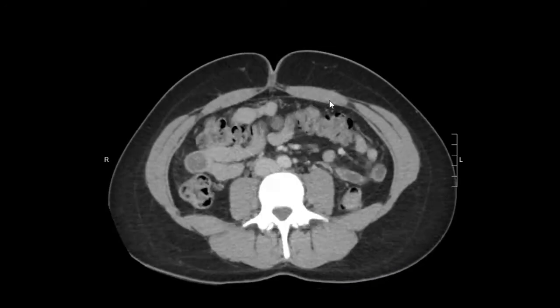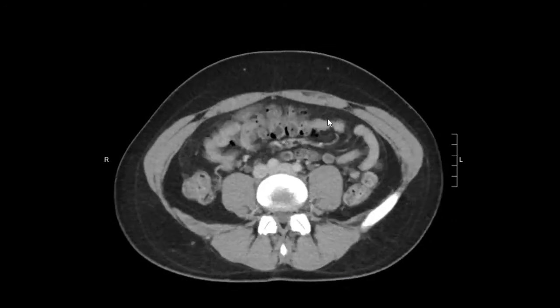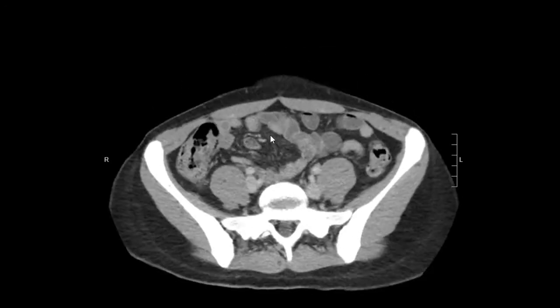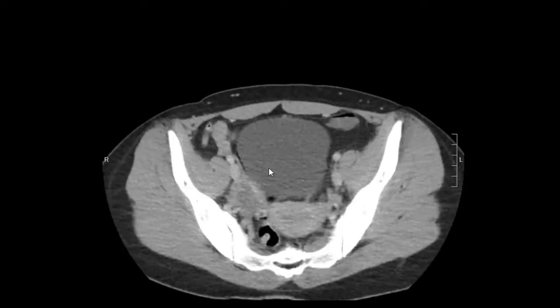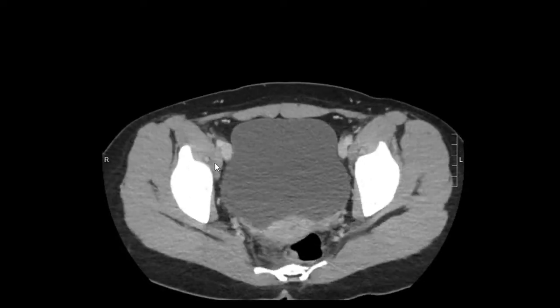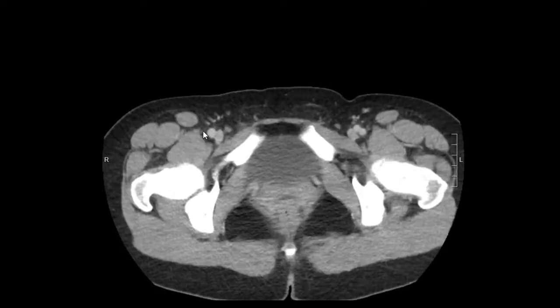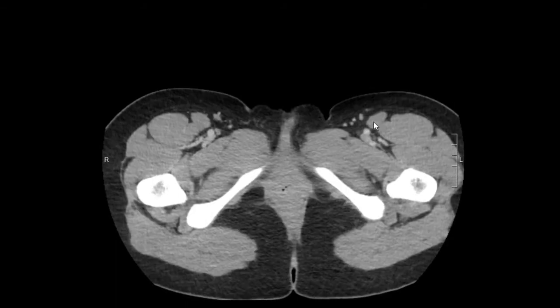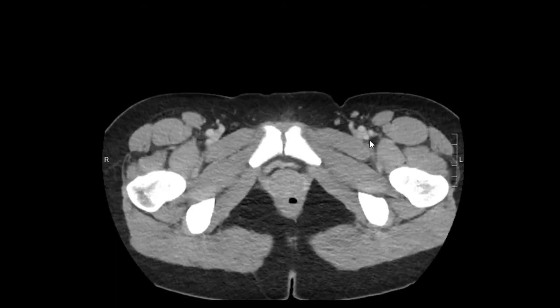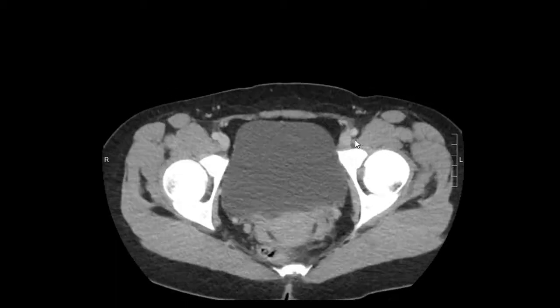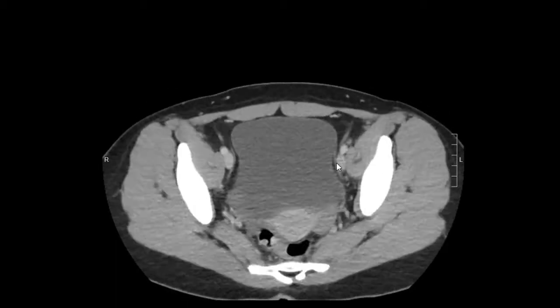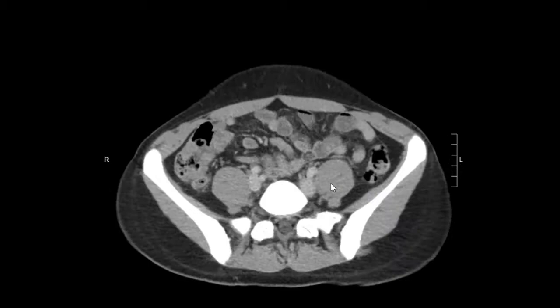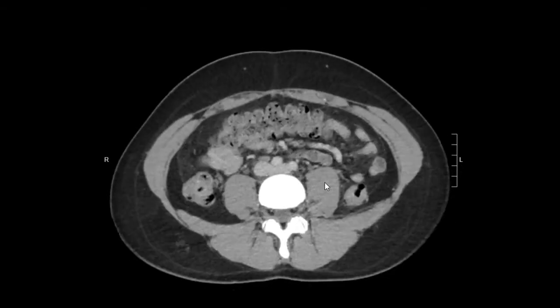We'll just follow the aorta more distally into the right iliac chain coming down here, and then the left iliac chain — we'll follow that coming up. And everything looks pretty normal.